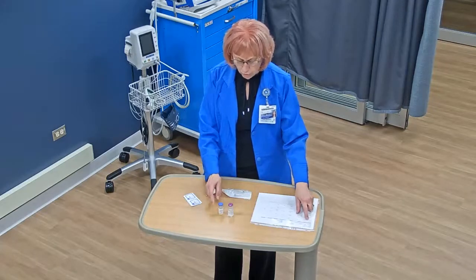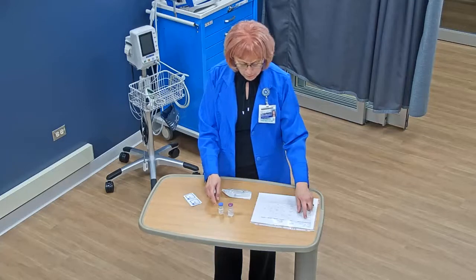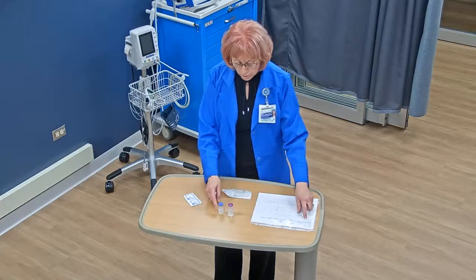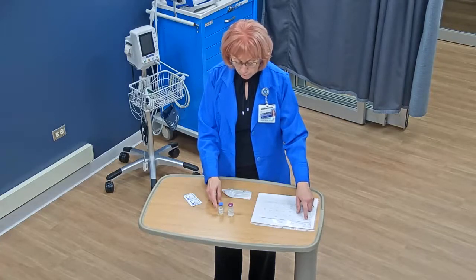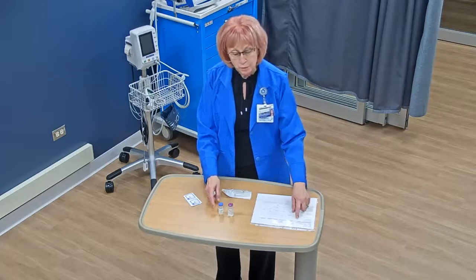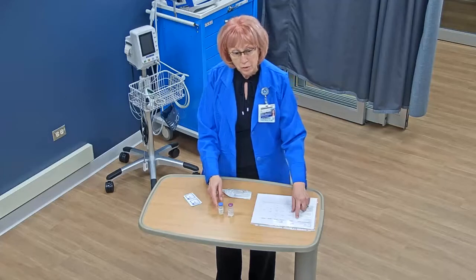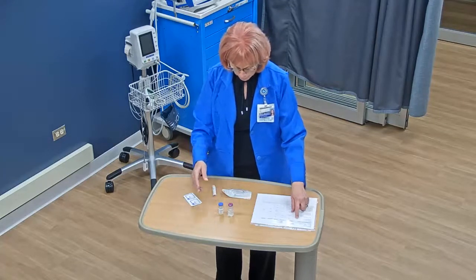I have to reconstitute it with 2.8 milliliters of liquid and that's going to yield 3 milliliters. Once you add the liquid and the powder together, you have 3 milliliters — 500 milligrams in 3 milliliters. My order is for 250 milligrams, so the actual dose I'm going to draw up and give to my patient is 1.5 milliliters. I'll go through that as we go through this process.